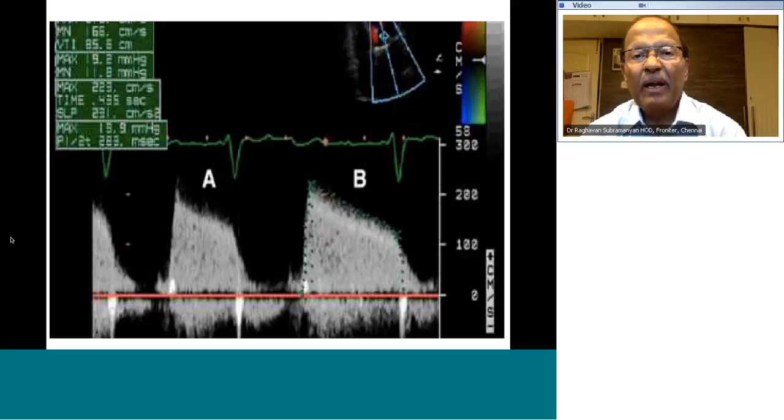You have to be quick, otherwise we won't be able to finish all the spotters. Okay, since I'm not getting any answer, I'm going to go ahead with the description.